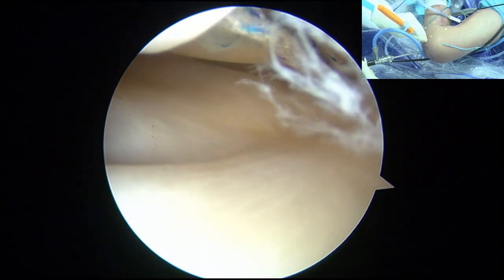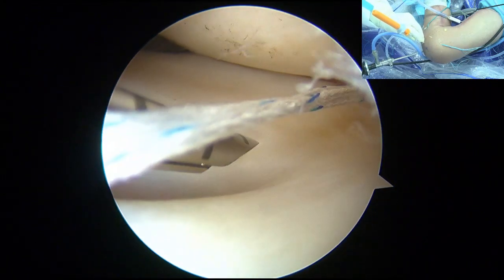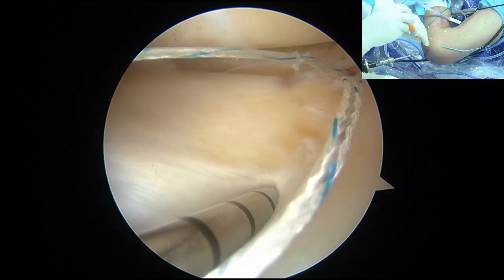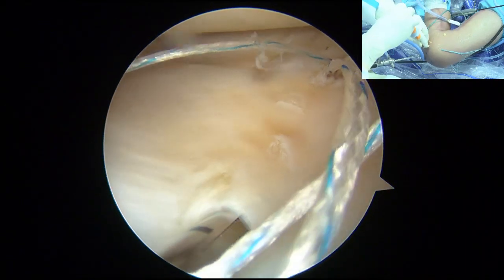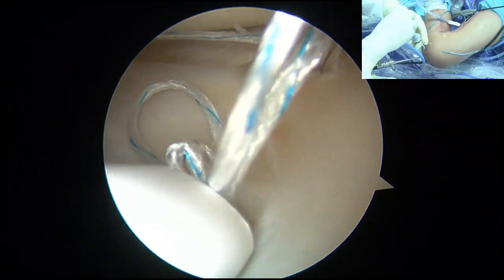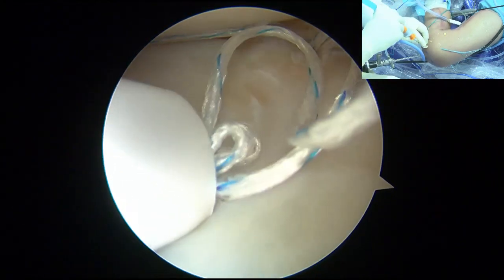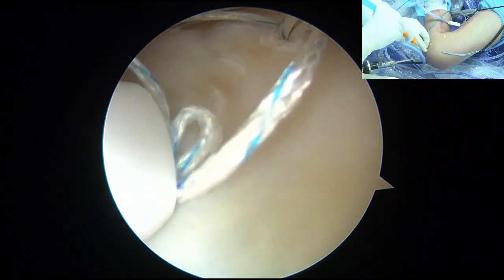Okay, we drag this out a little bit. 然后回抽 yeah. Okay, and repair. We try to make it vertical because this is stronger. Okay, this way. 形成垂直入式缝合，垂直走向的布线呢就更加结实。Slowly put it in. Okay, and then you kick. 然后触发。来了。Okay, good. It's not getting out.